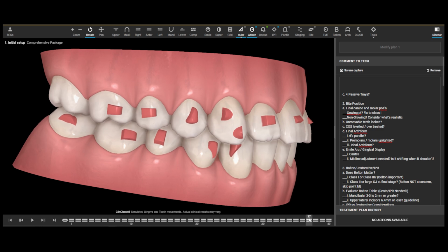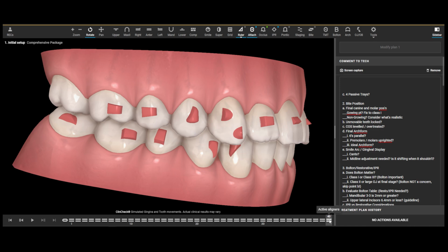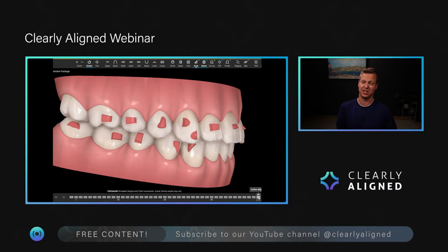These teeth are absolutely moving right now. So that means that when the patient finishes treatment, at tray 40, she's going to have to hold in that tray for potentially 4 weeks, 3 weeks, 5 weeks. What happens when she loses her tray and things start shifting and moving?